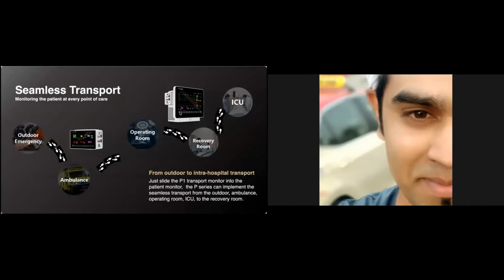Second point, I think I'll clarify. The portable monitor which we have, the small module, is going to be moved from one department to another. So in terms of the options for the monitors of the series, can you use this module and connect it along with the cable to a medical grade monitor as a slave monitor and actually operate? Is that option available or no?